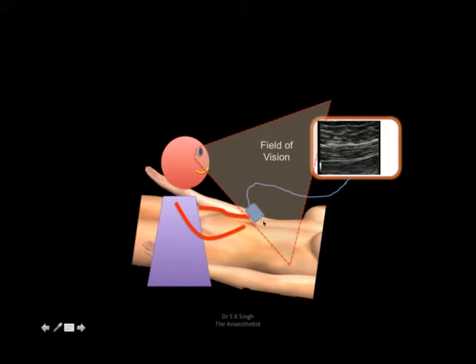If you're doing the block for the right side, we stand on the left side of the patient and the machine is on the other side. You can move the machine to the other side when doing the left side of the block, or move it from the head end to the leg end and introduce the needle again from medial to lateral. So it can be done from the same side as well — you just need to move things around.